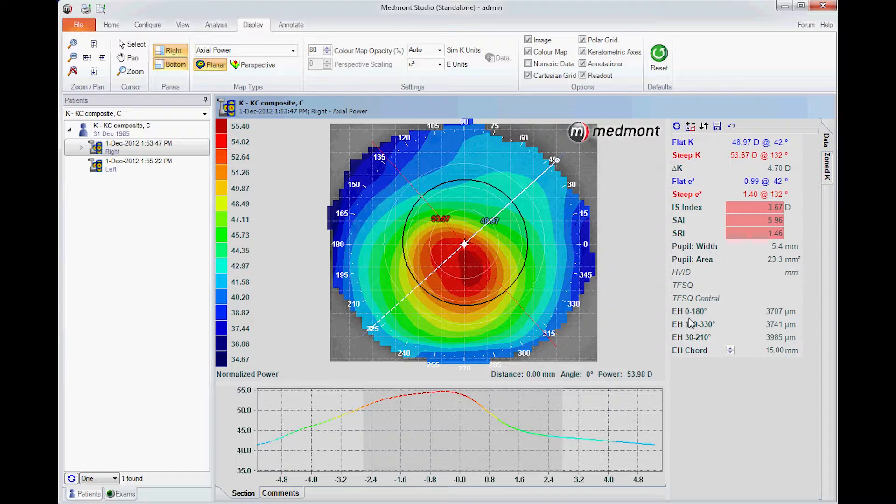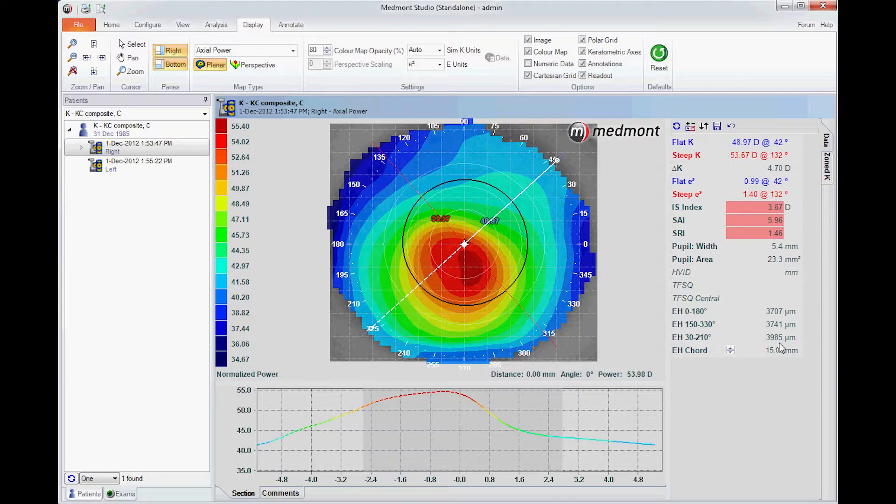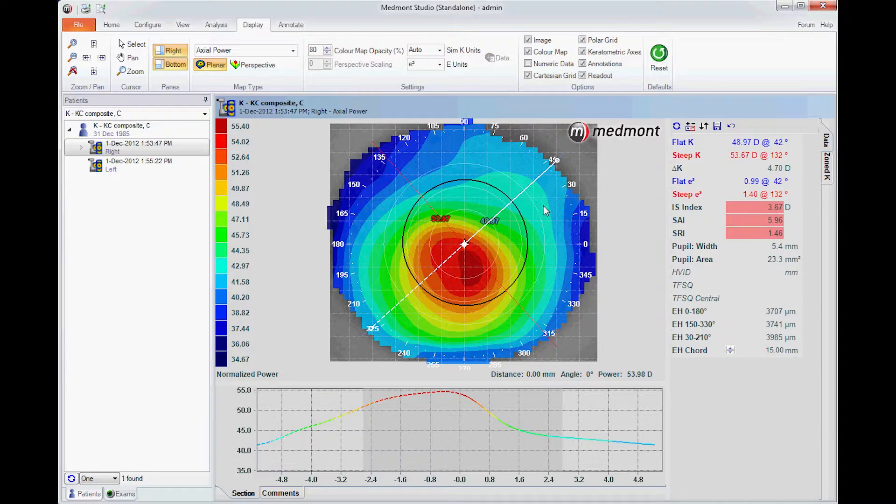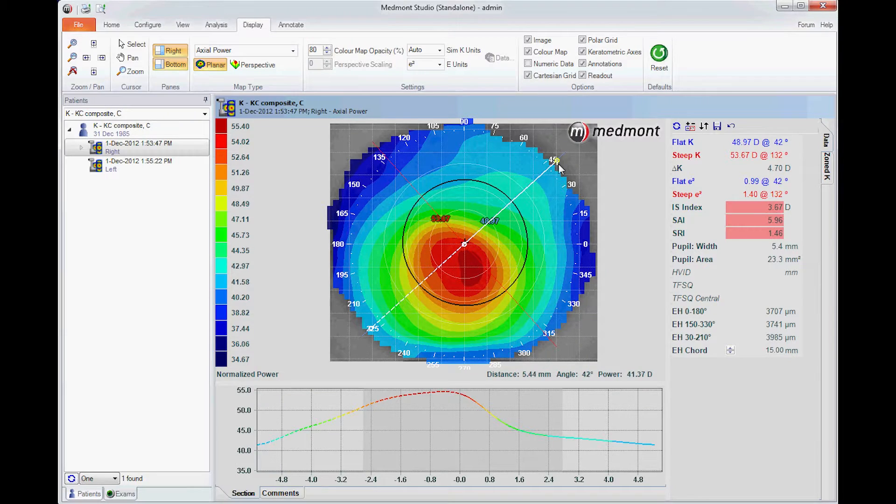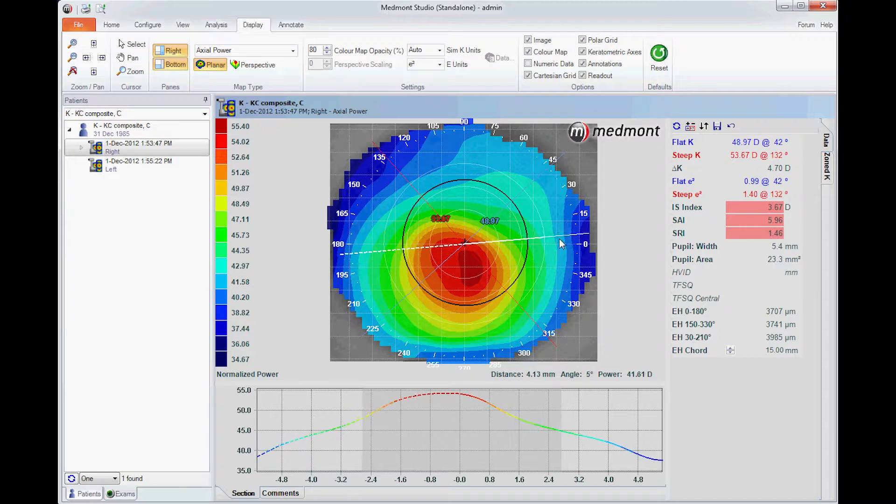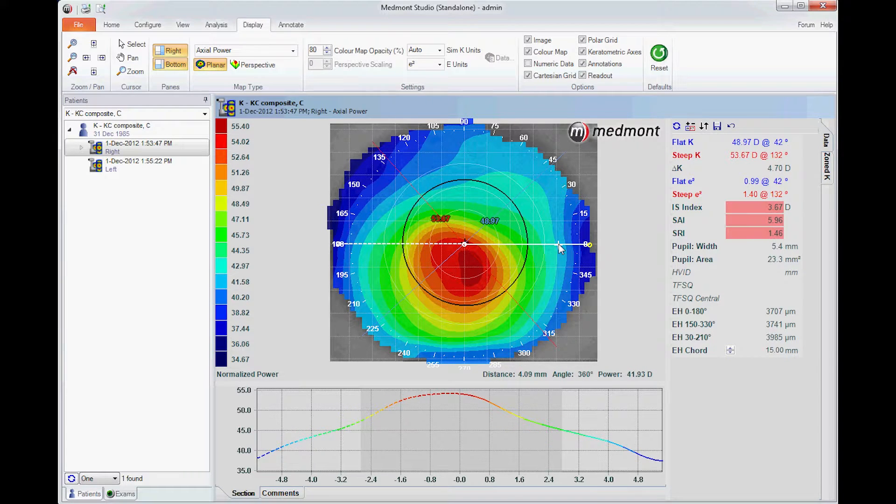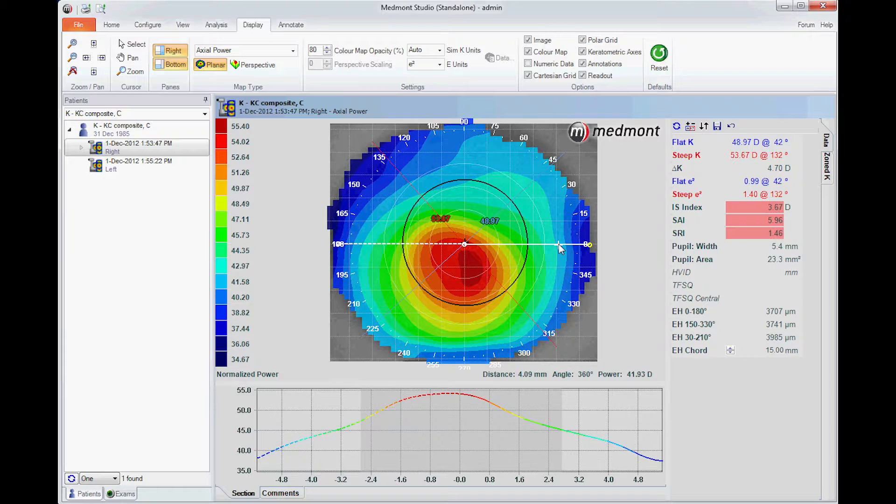Then the estimated height across the 0-180 meridian or the 150-330 meridian or the 30-210 can be used to estimate the height of the eye where the best possible imaging is available. Generally near to the horizontal meridian is where we can get the largest area of capture to estimate the height of the anterior segment.